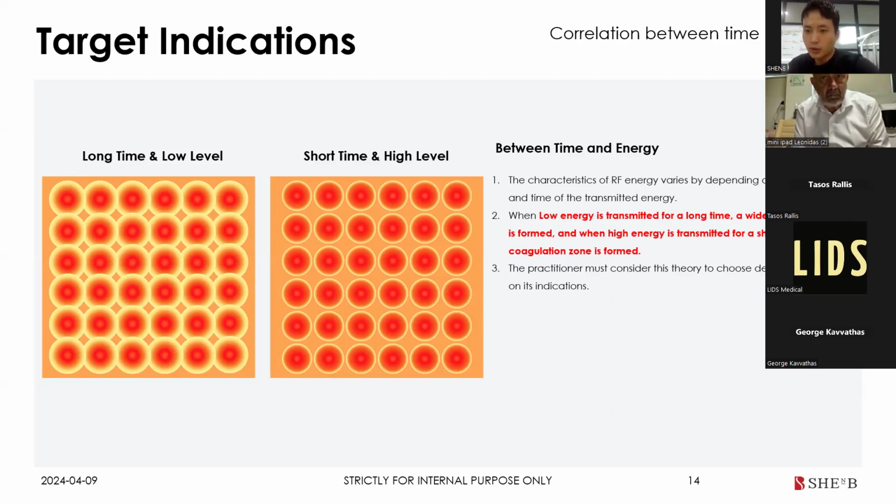This also makes a difference when we want to do face contouring or body contouring kinds of indications, because if we do a continuous wave with a strong energy, it generates a coagulation zone close to the needle. So if we want to target an indication that we can see visibly on our skin surface, it's better to use continuous wave.